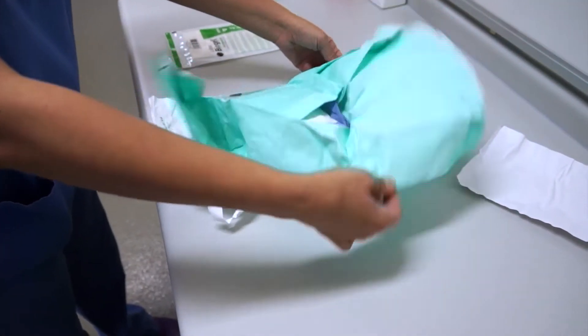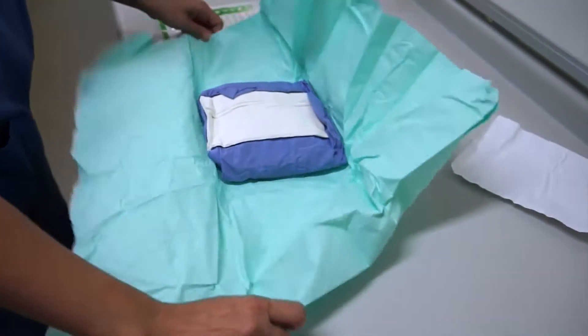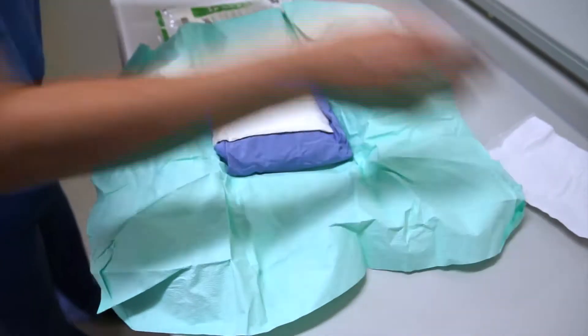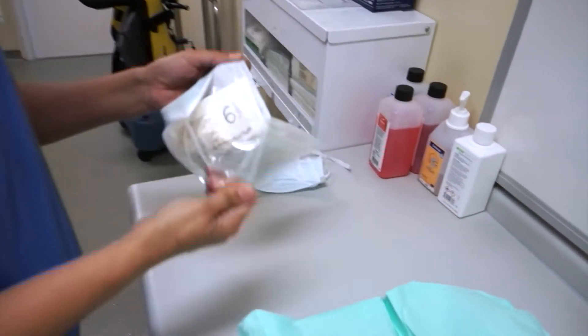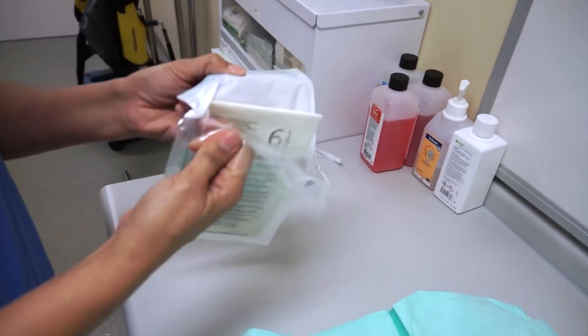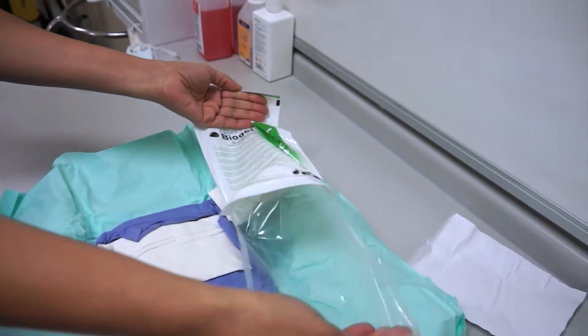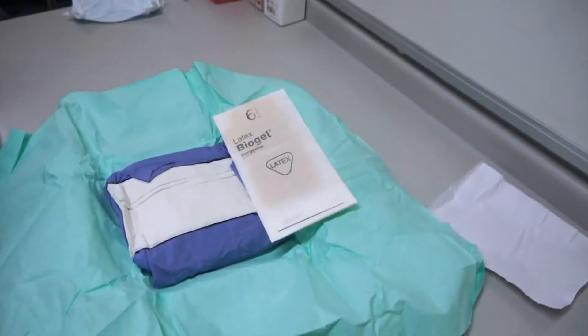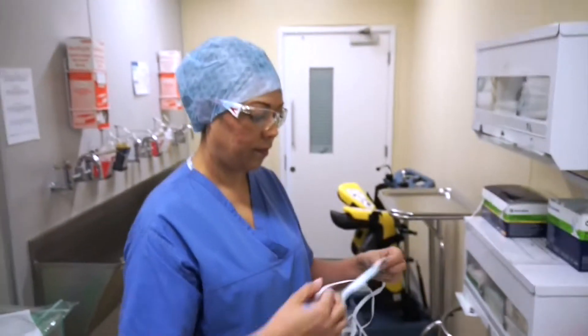I'm opening my gown now, ensuring that I don't touch any of it — you're just touching the very, very edges of the gown pack. Just the very edge of the pack. Now I'm opening my gloves, putting my gloves above my gown so I don't touch them later on and I'm able to get my gown out. When opening that packet, you just get the very edges of the plastic — you don't touch the little wrapping that the glove comes in at all.